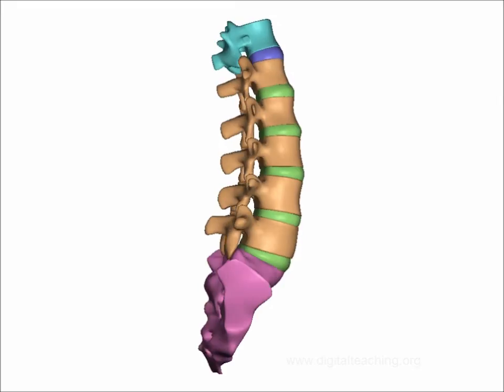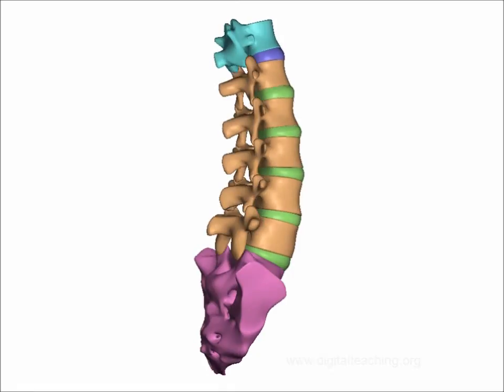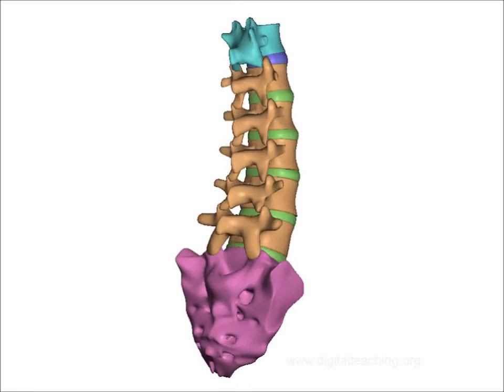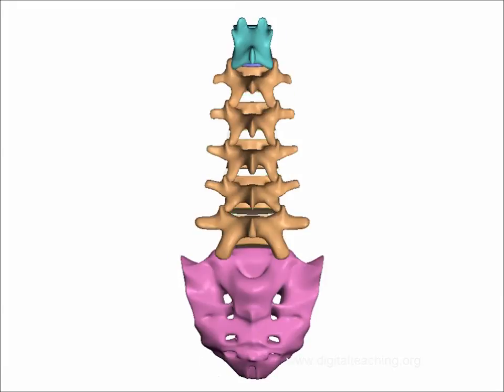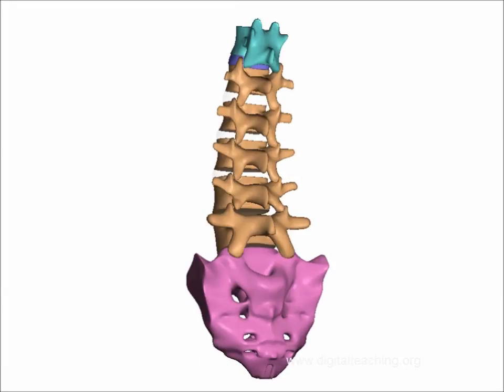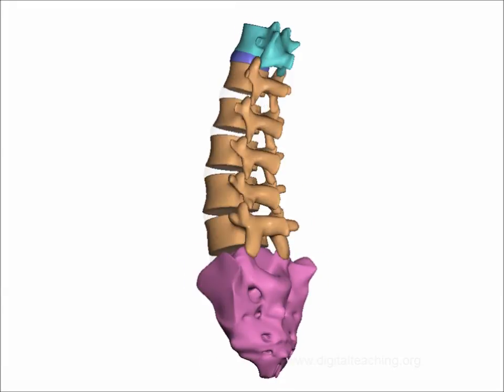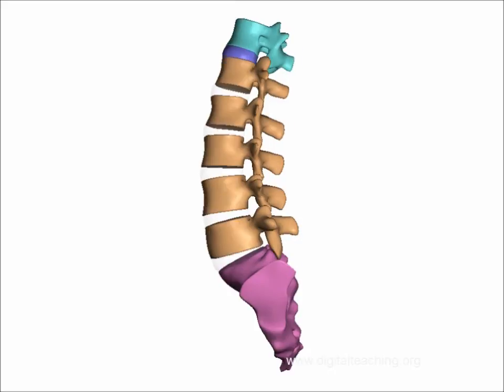Now just observe how transverse process becomes mouth of the dog. Ear and tail is superior facet. Neck is pars inter-articularis. Legs is inferior facet. Body is lamina.